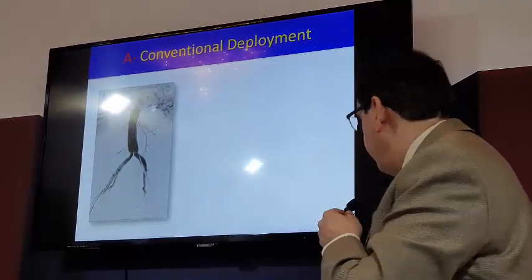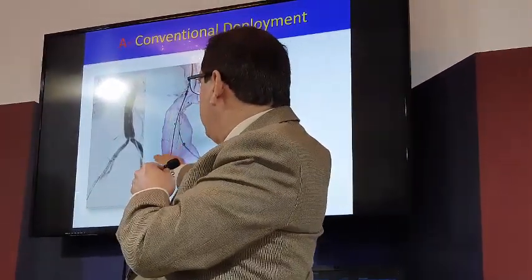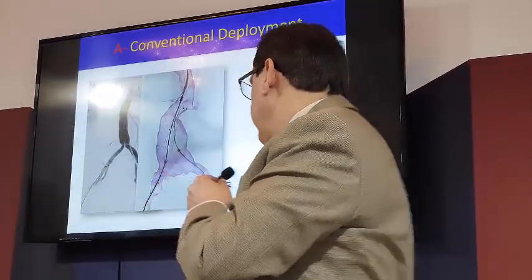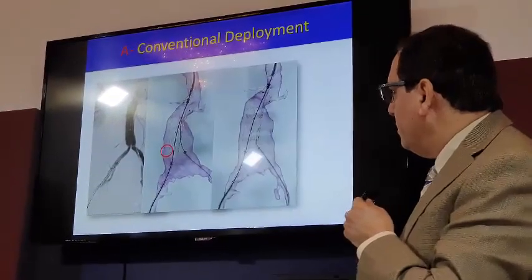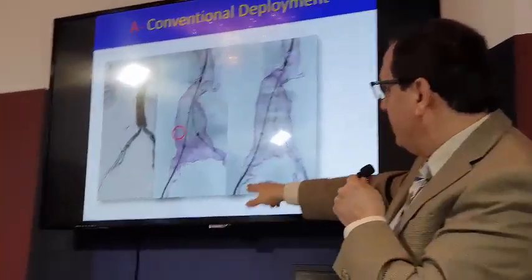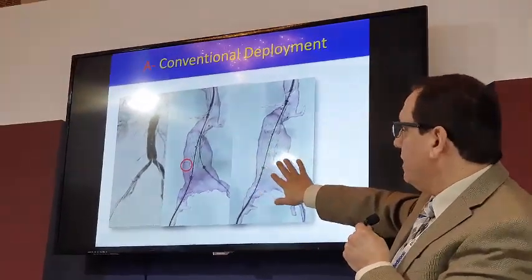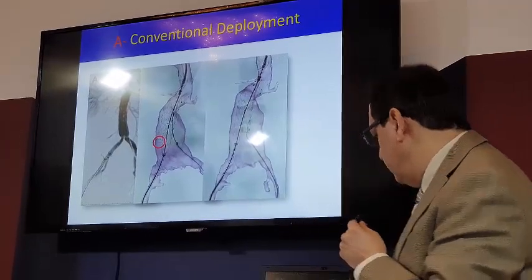Then if you deploy it in ballerina, in the opposite position, you see your catheter is here and your gate is here. It will be very hard to cannulate. So in this way, it's better to deploy it in a straight, normal situation, where this is the main and this is the left, and it will be very easy to cannulate. So in this situation, I'll deploy it as a conventional standard deployment.